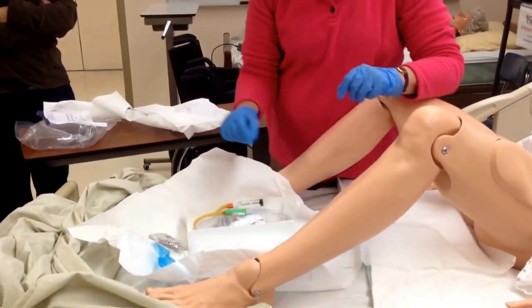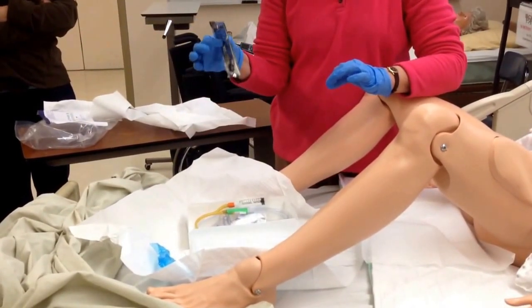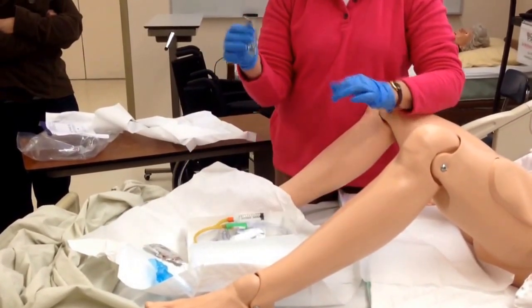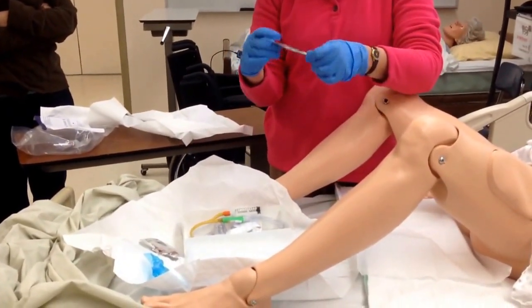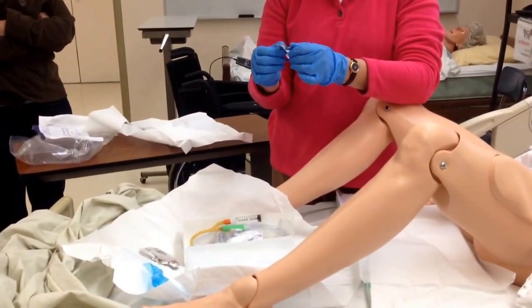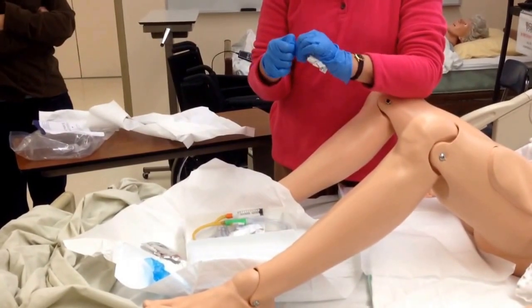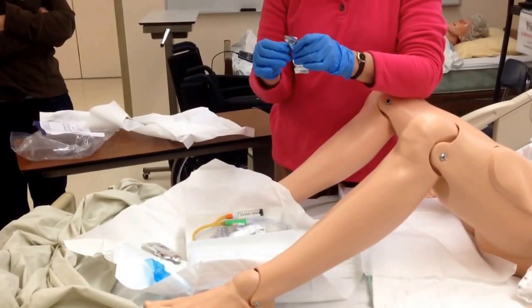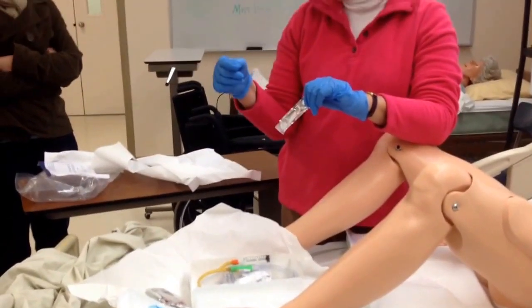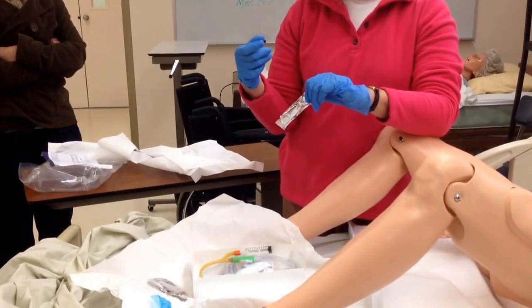So, next thing we're going to do is open up our swabs, and I'm not going to open this up, but I'm going to demonstrate what you would do, okay? But I also need to open up my lubricant. Now, there are some kits that actually have a syringe full of lubricant, and it's okay, on a male patient, not on a female, to go ahead, after you've cleansed the meatus, and take that syringe and inject all that lubricant right into the penis.